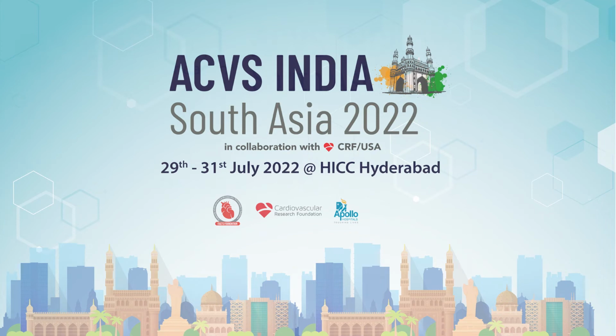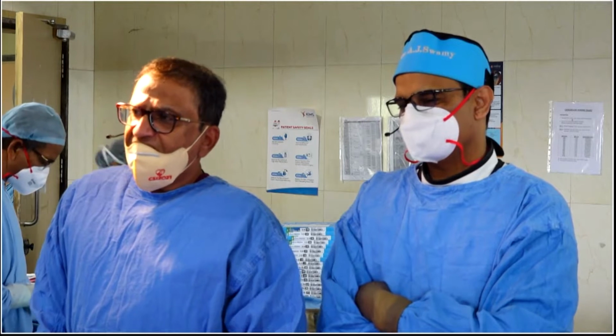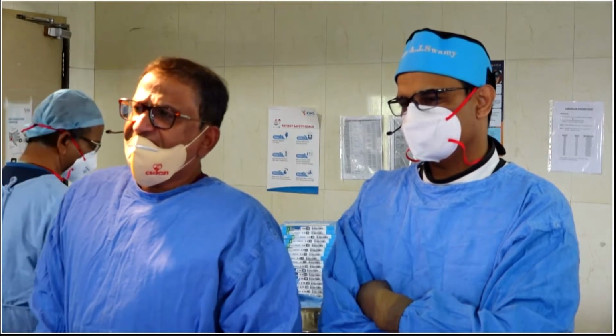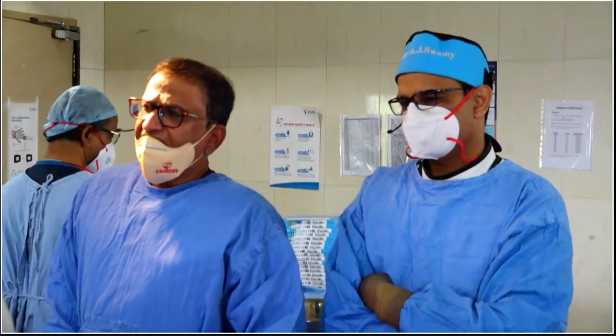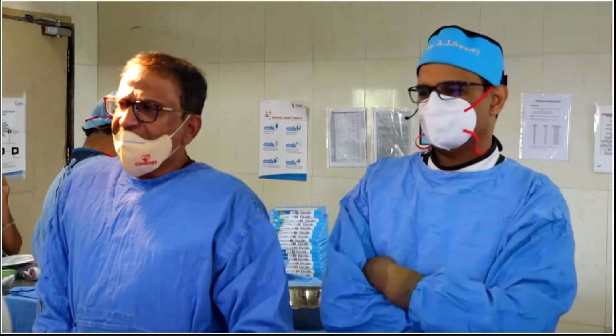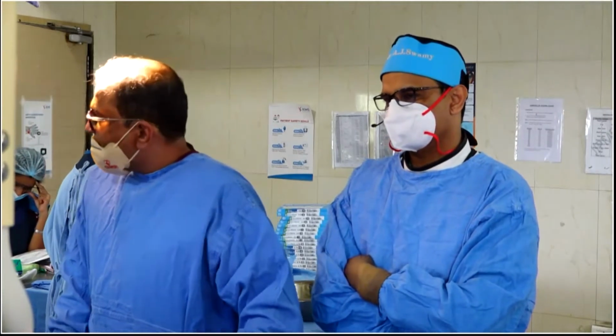Good afternoon and welcome. Thanks to Dr. Srinivas Kumar for giving us the opportunity to do the live case from KIMS Secunderabad. And today we are doing a live case. The live case we have selected today is a very interesting case. It's almost a no contrast PCI of RCA using OCT imaging. Okay. So can you show the slides, please?